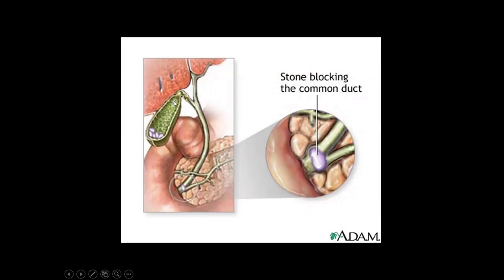Here we can see the gallbladder with multiple calculi, cystic duct, common bile duct, pancreatic duct, and accessory pancreatic duct. In this picture you can see a stone in the distal portion of the CBD.